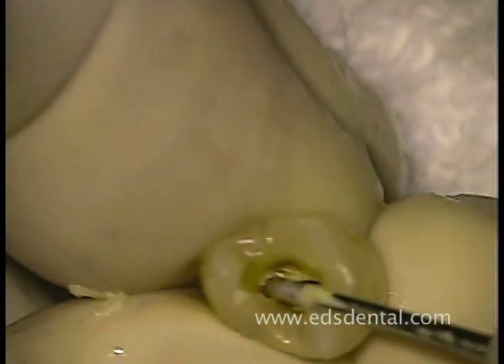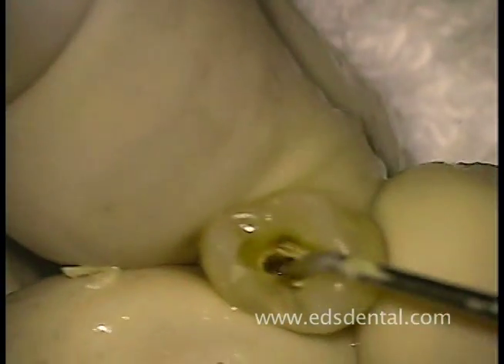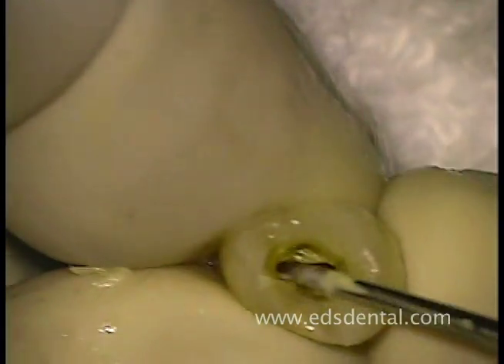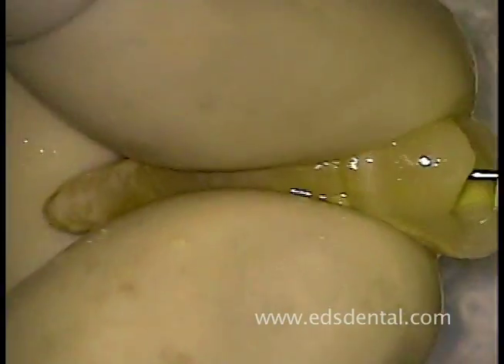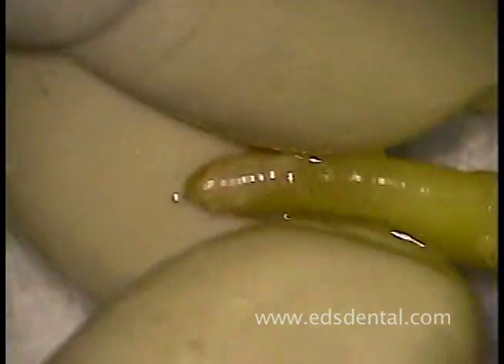Here you clearly see the two canals after they have been straightened and widened with the tapered Peeso. After using the tapered Peeso, we make sure that we still have patency by negotiating beyond the constriction with the number 20 relieved reamer.